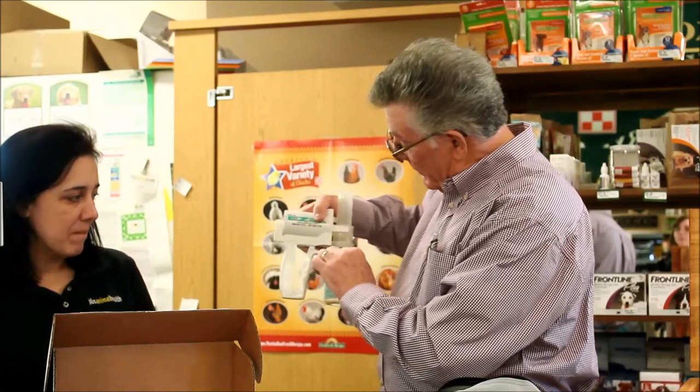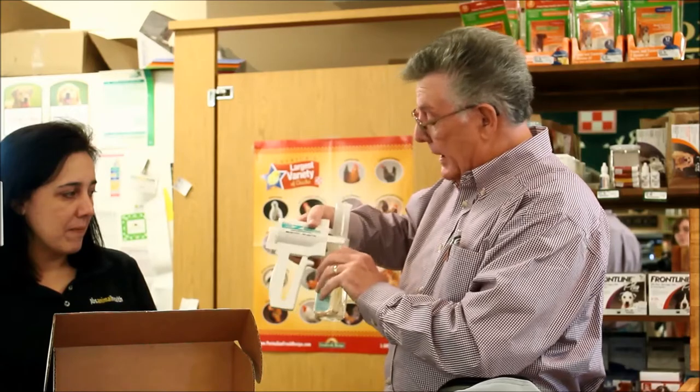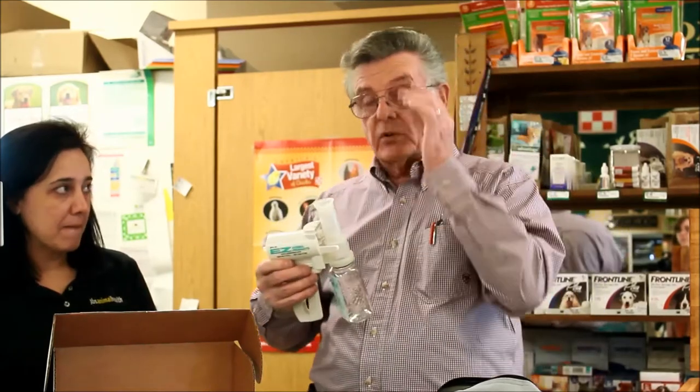There's also a little line drawn on top where you can write the animal's name and the date that you took it. Never go above that line, because we don't want to get milk or colostrum into the pump.